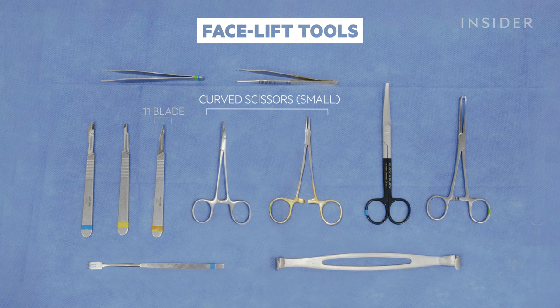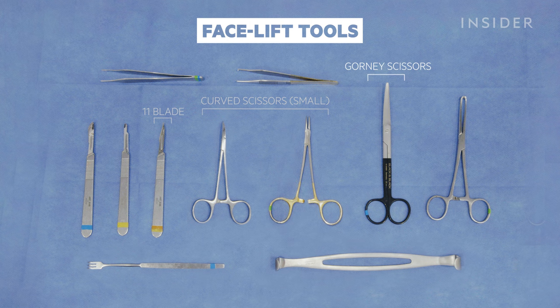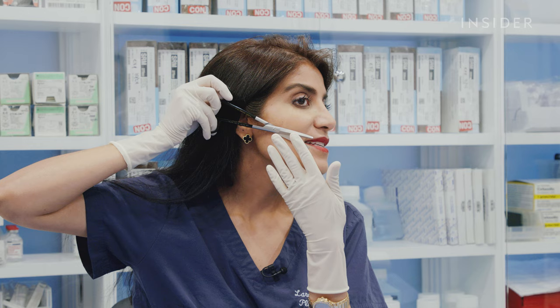In order to do that, I'm using a series of scalpels, small fine curved scissors, and larger curved scissors in escalating sizes. And this is one of the most amazing instruments in all of plastic surgery. It's called the Gorney scissors or the facelift scissors. So they're inserted right here all the way into the face. So it's very cool, but very high stakes.